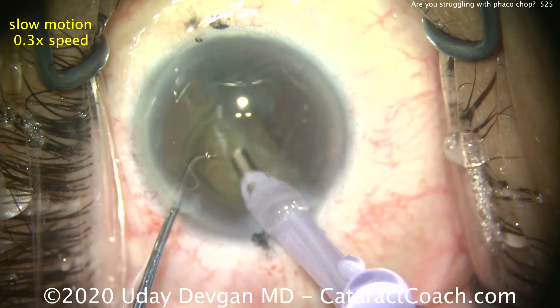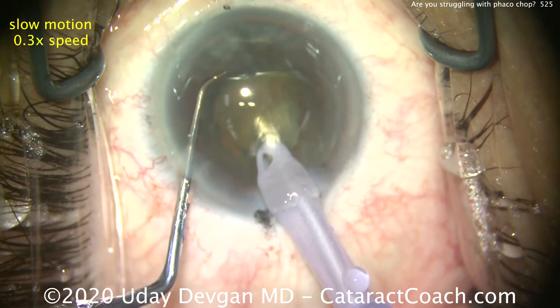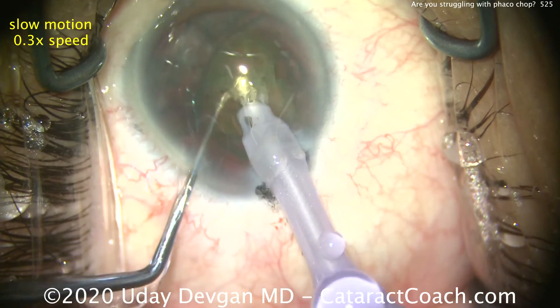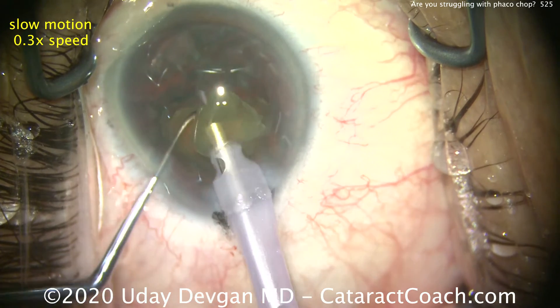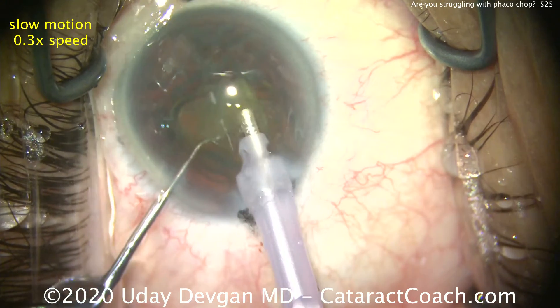Now we're done with the first half. Here comes the second half. Buzz into it, bring it up. Chopper goes around the lens equator. Bring the instruments together and then apart, and we've broken off another piece. Give a little modest energy. Use the chopper to push the piece and keep it in front of the FACO probe.